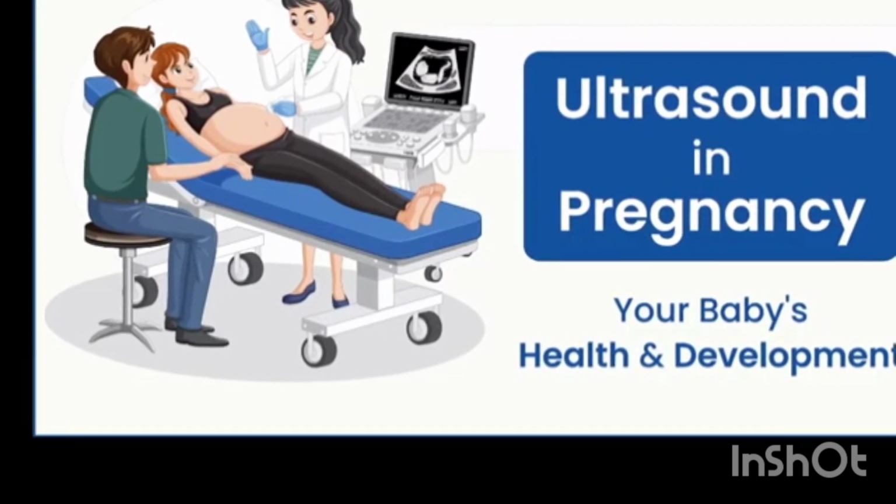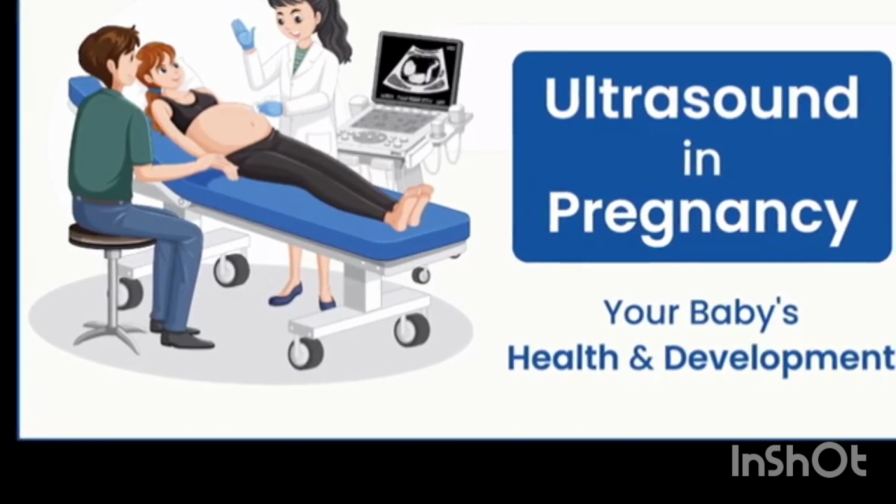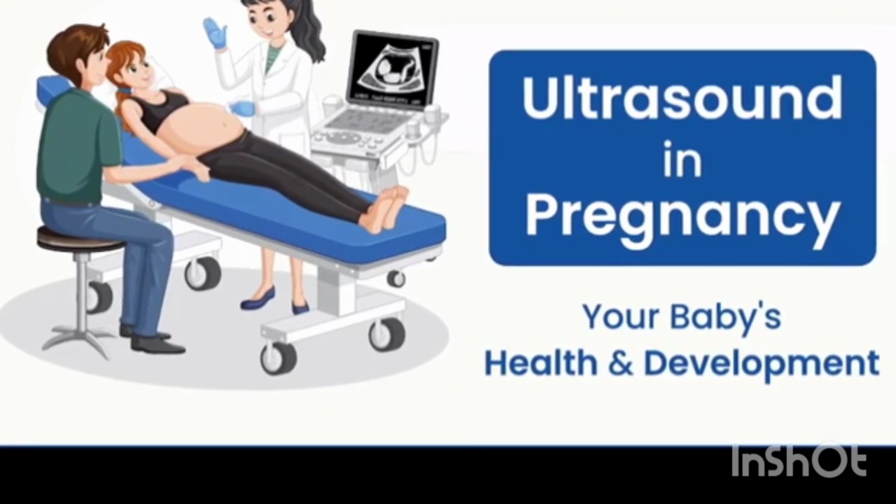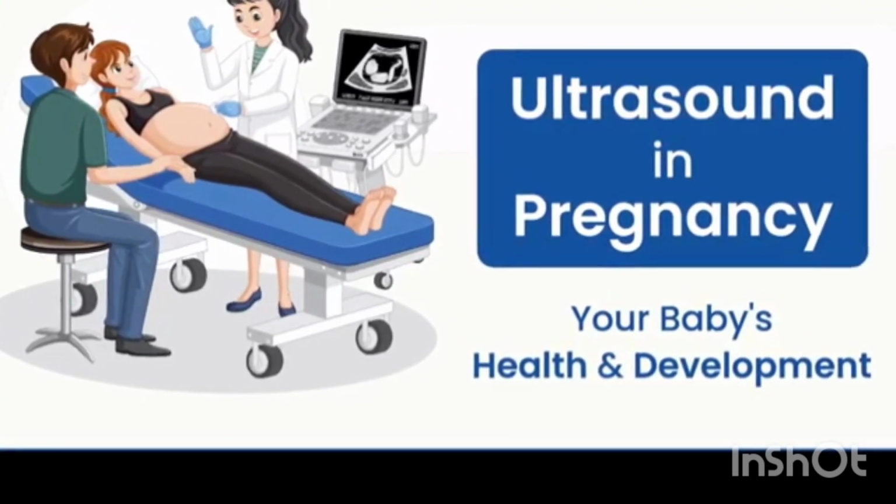However, it should be noted that the accuracy of the ultrasound really depends on how many weeks the woman has been pregnant. The longer it is, the easier it is to be sure of the baby's gender.